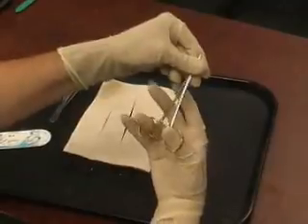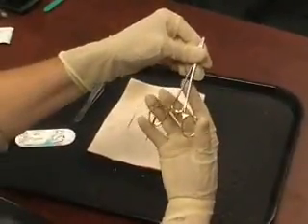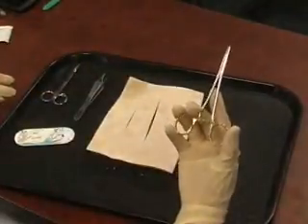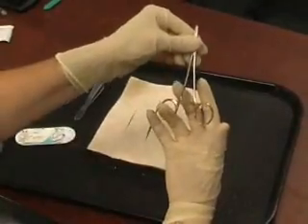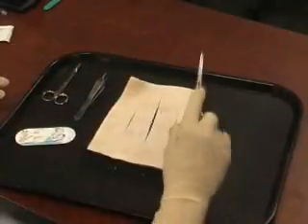It's important not to put your fingers all the way in the ring holds. Some people actually suture by holding the instrument outside of the ring holds, but I highly recommend that you just put your DIP in. It gives you really great control. So this is the tripod grip.